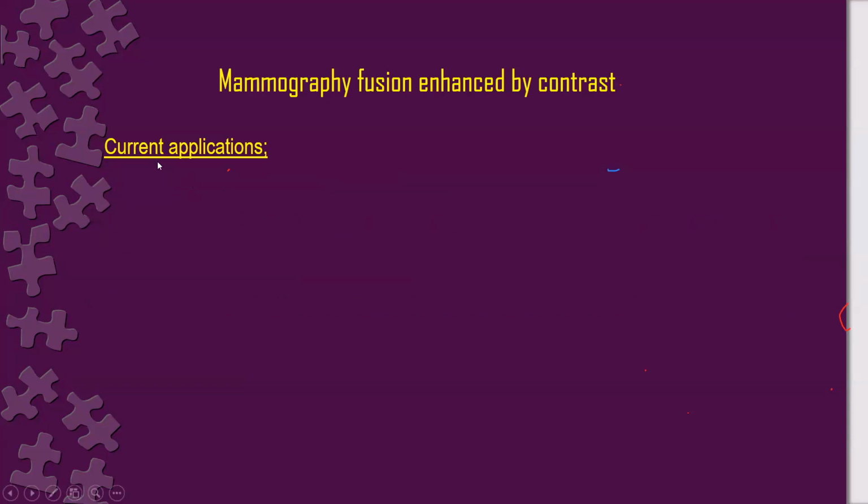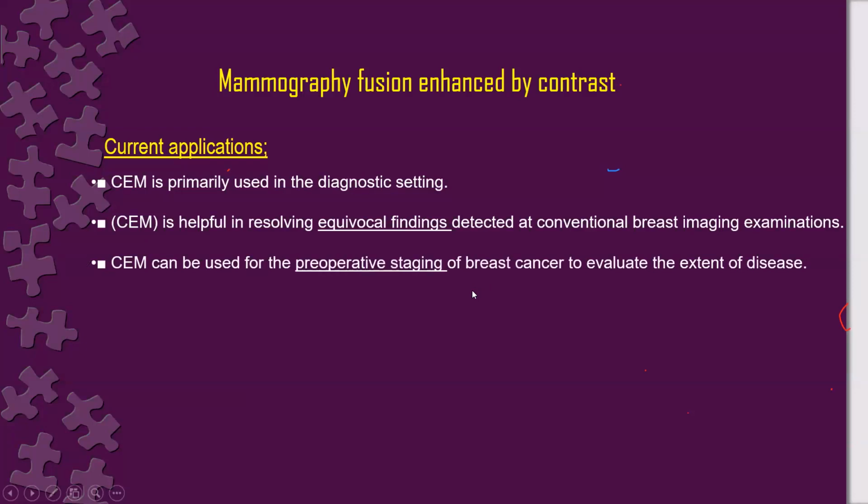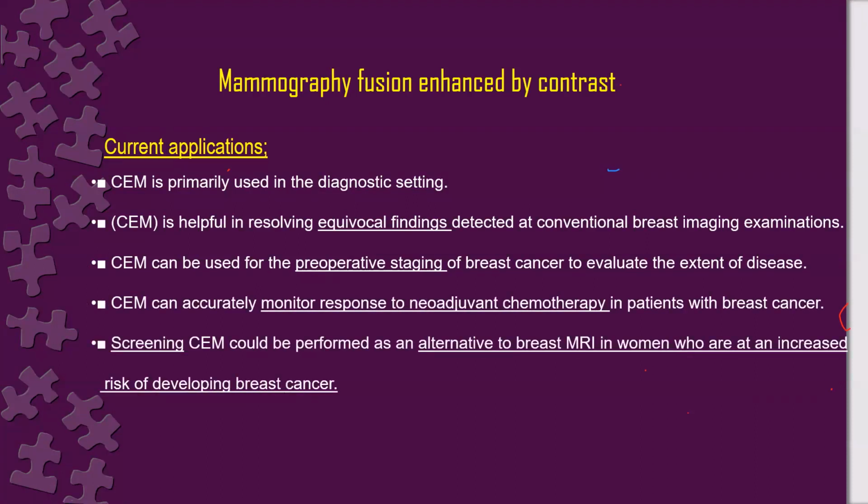Okay. So the current application of contrast-enhanced mammography is primarily in diagnostic settings, and it is helpful in problem solving of equivocal cases, and can be used for preoperative staging of breast cancer and to monitor response to neoadjuvant therapy.